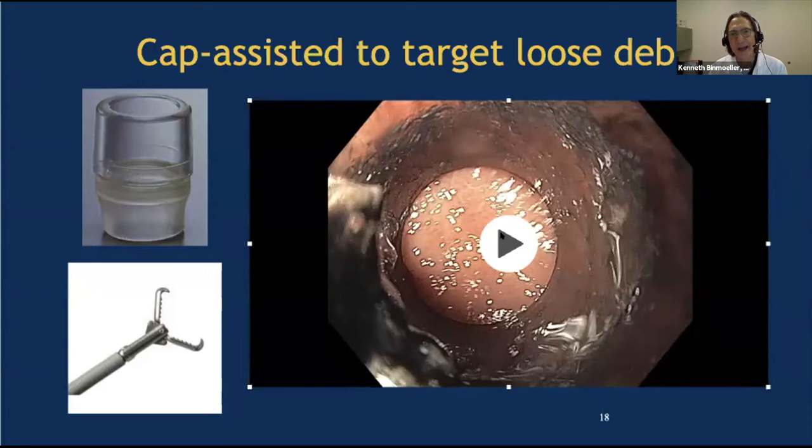I actually drove my echo endoscope inside the WON once and looked around. It lights up like a Christmas tree with vessels. And of course, you've got really mean players like the splenic artery there and the hepatic artery, et cetera. So you need to be really careful when you're doing necrosectomy. It should never be blind.